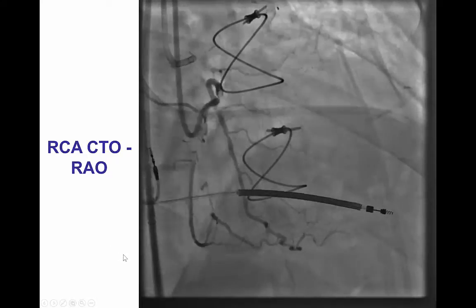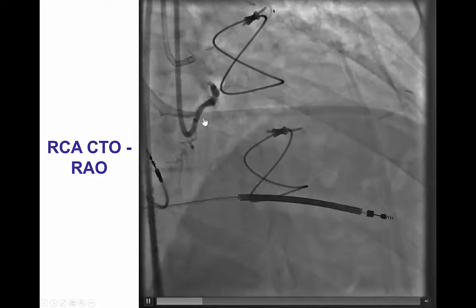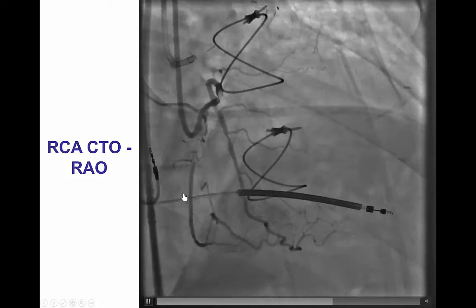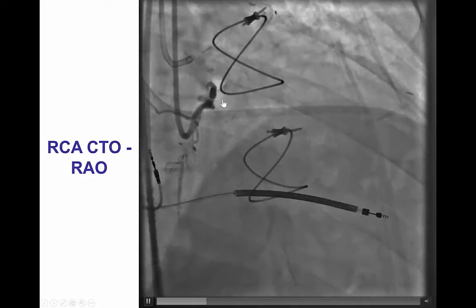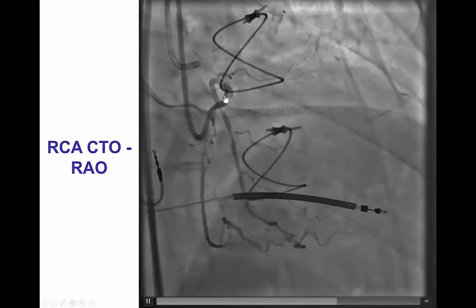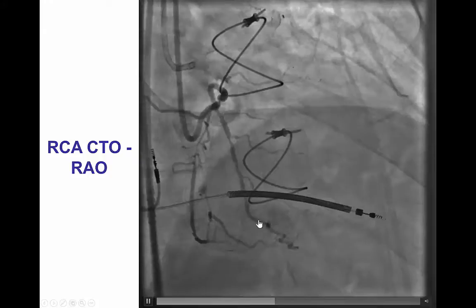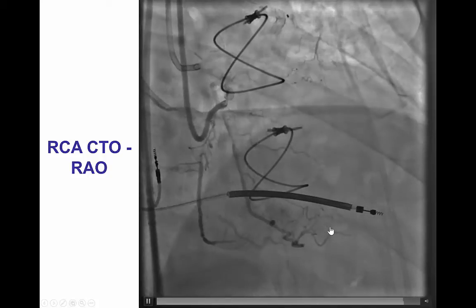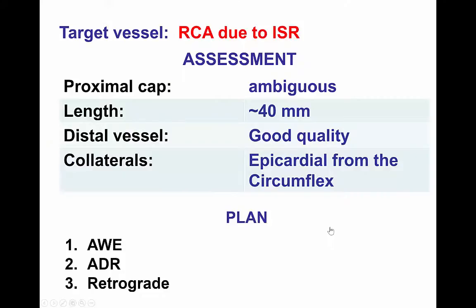In the RAO view, we see the same characteristics. There is an ambiguous proximal cap and good quality distal vessel. There is also a very large early conus branch that courses all the way to the inferior wall and essentially acts as a second PDA.